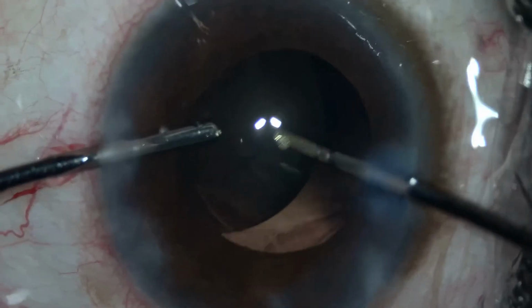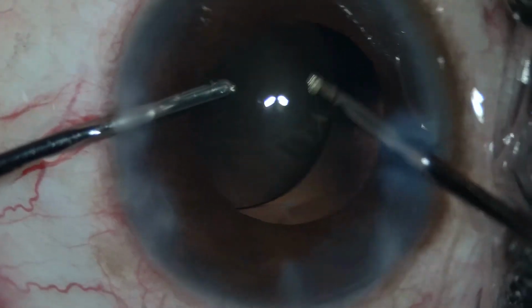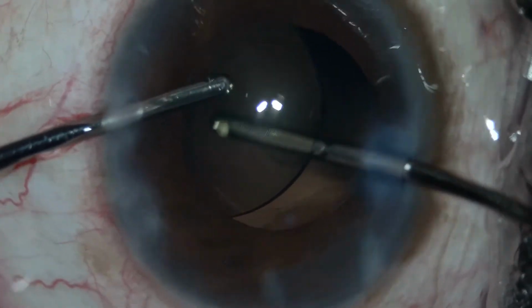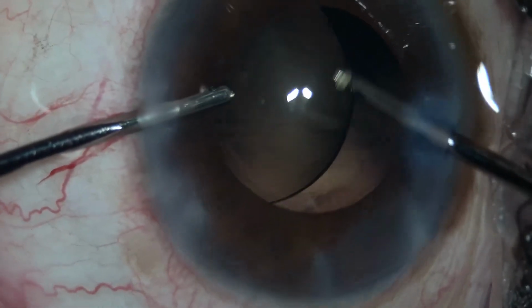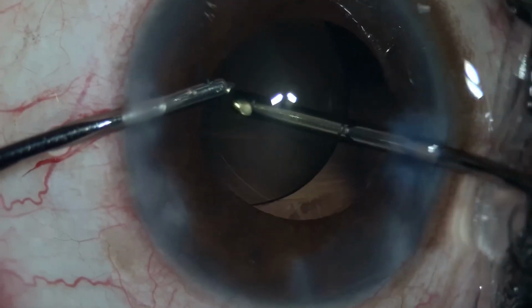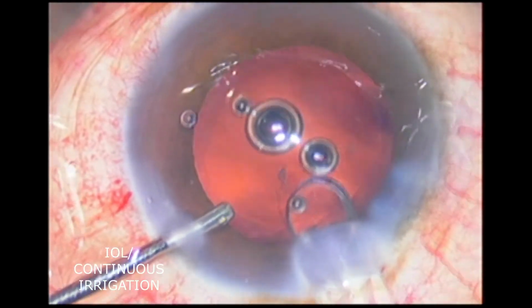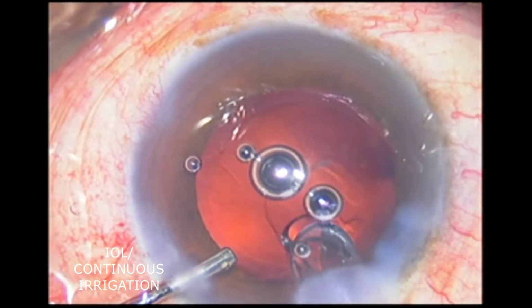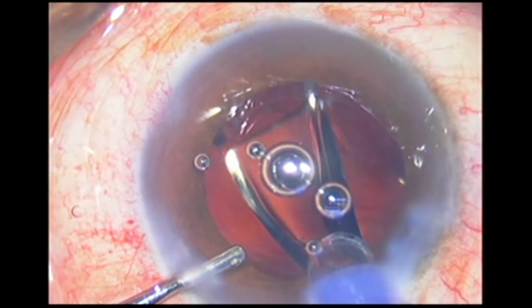Near complete aspiration of OVD from the bag is a crucial step in minimizing this problem. IOL implantation under continuous irrigation prevents retention of OVD in the bag.